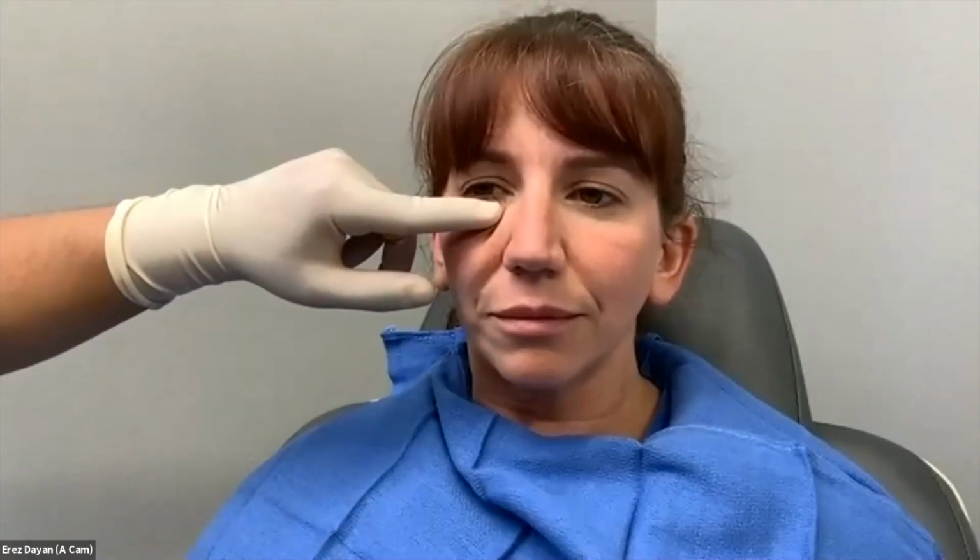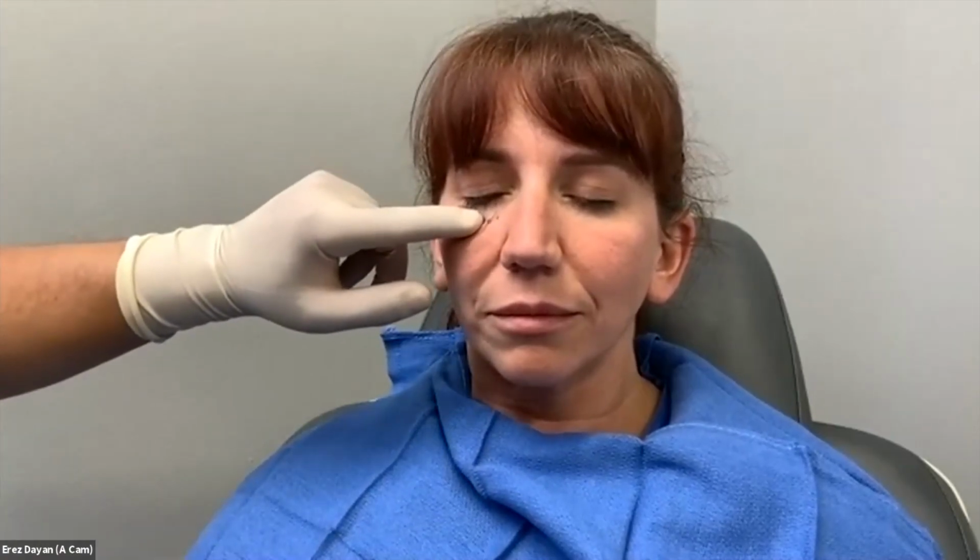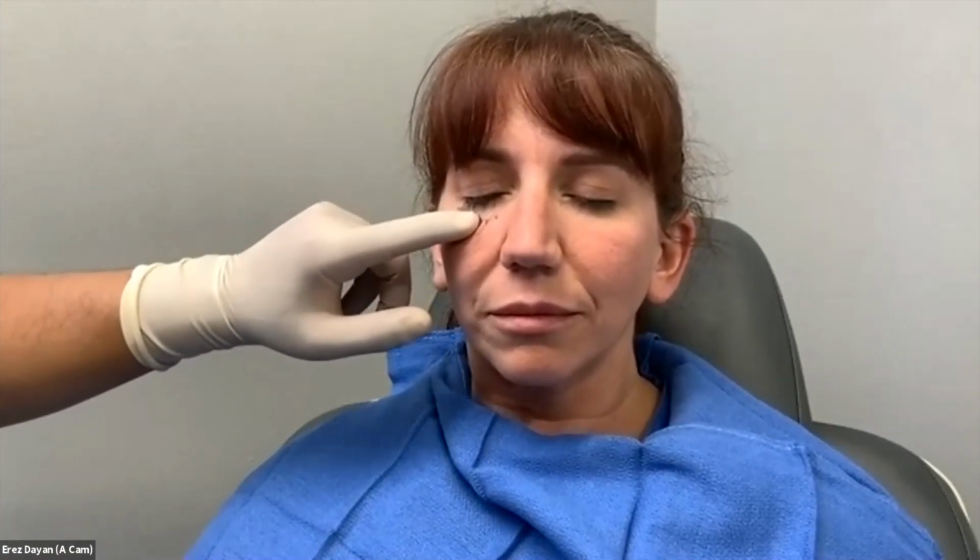So you're going to put the internal cannula in through an 18 gauge needle poke. The cannula is going to be right on the orbital rim. And you close your eye for me. So you see on her, she doesn't have much fat herniation, but for people that do, you'll see it right there. Your internal cannula will be right on the orbital rim, right on the periosteum. Really scrape the periosteum. You'll know you're in the right plane. It's a couple passes back and forth, and that's it. You hear the triple beep, you hear the slower triple beep, and you're there.